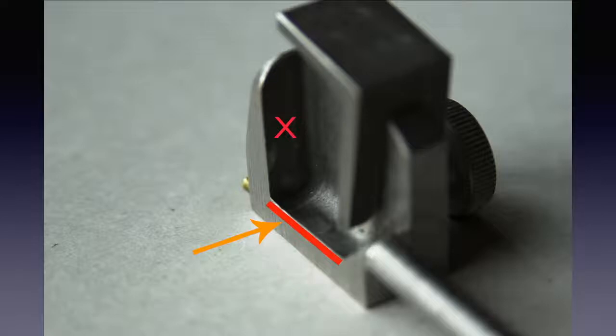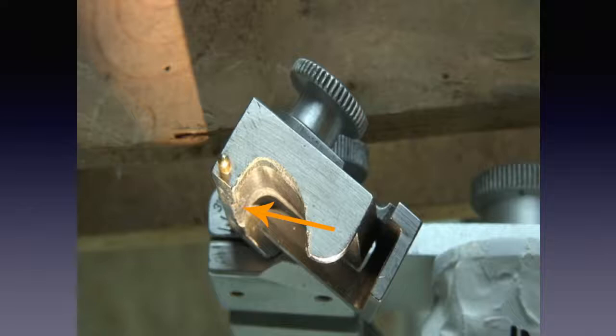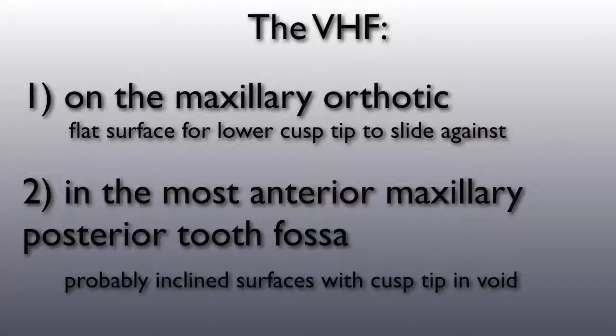In addition, the back wall of a Whip Mix is curved to accurately house the ball. That is a problem because if the patient's MI condylar position has a pure detrusion, that curved back wall will not allow the articulator to accept that condylar position. You have to cut the lip away in order to create a vertical, flat back wall.